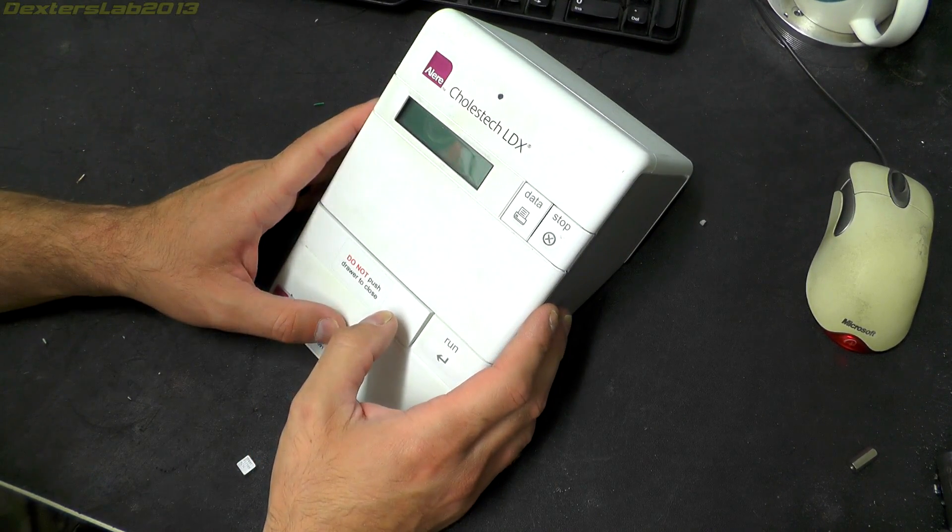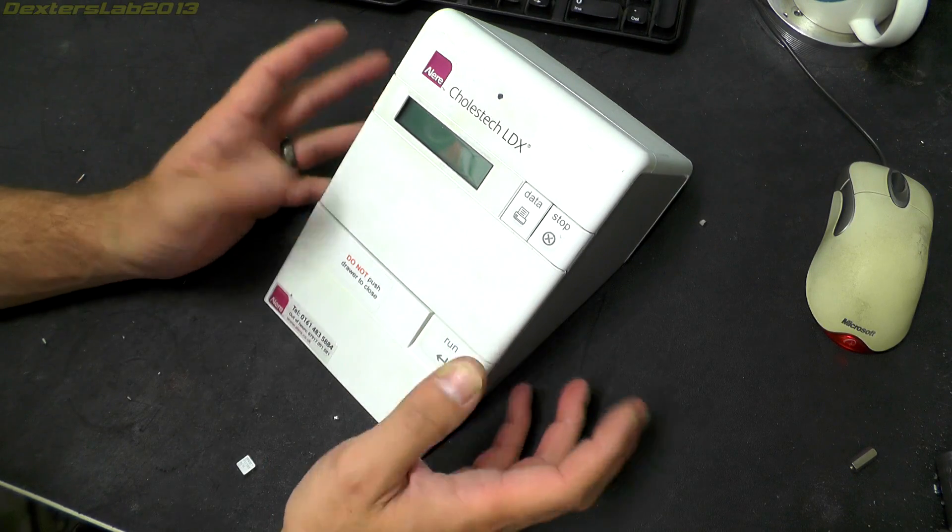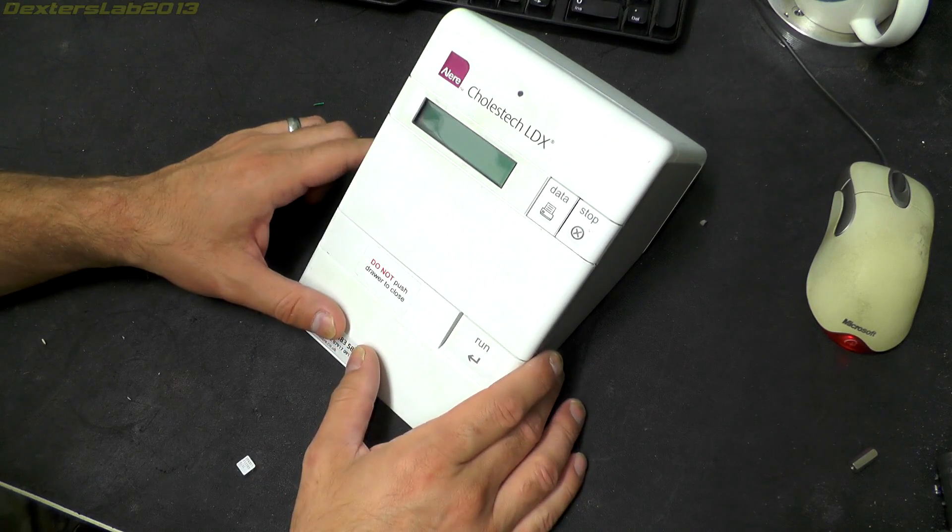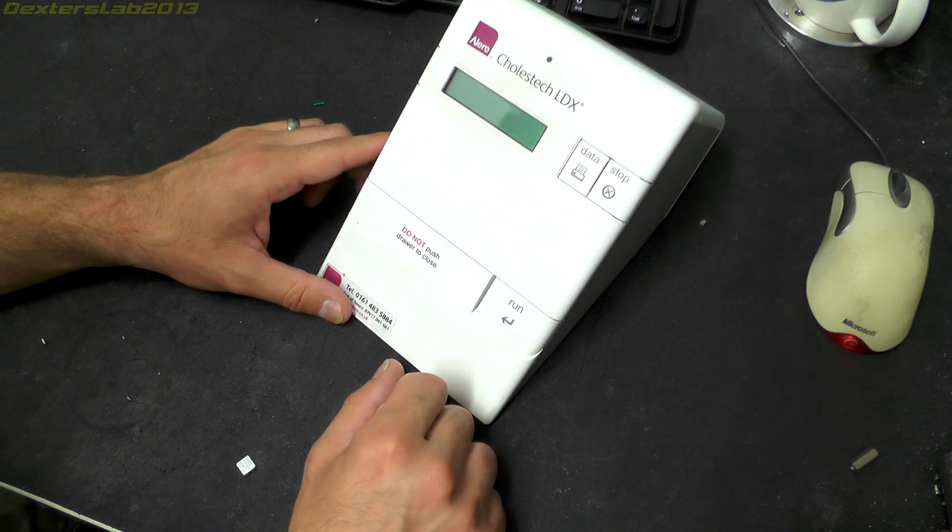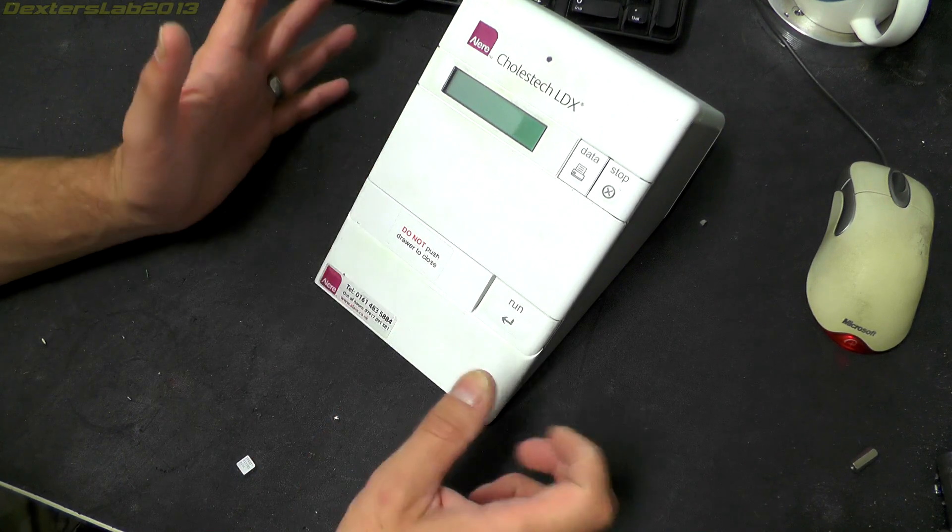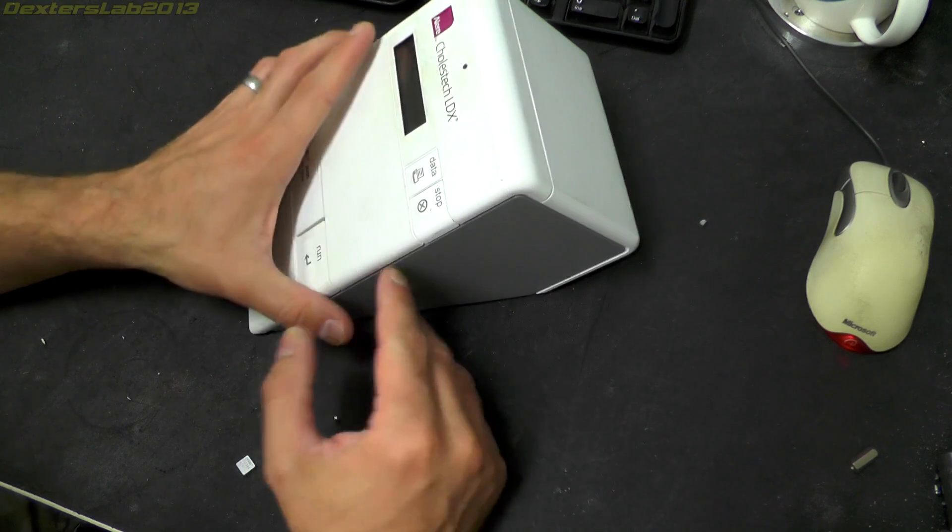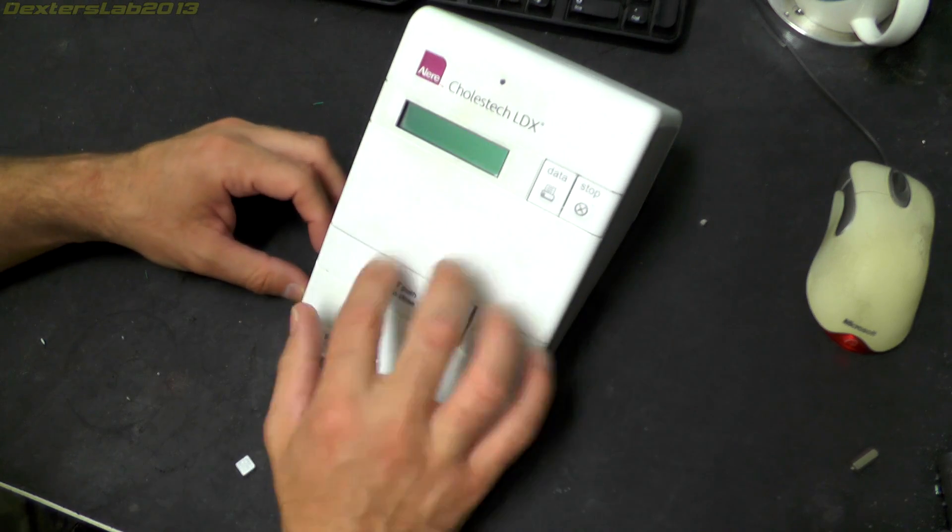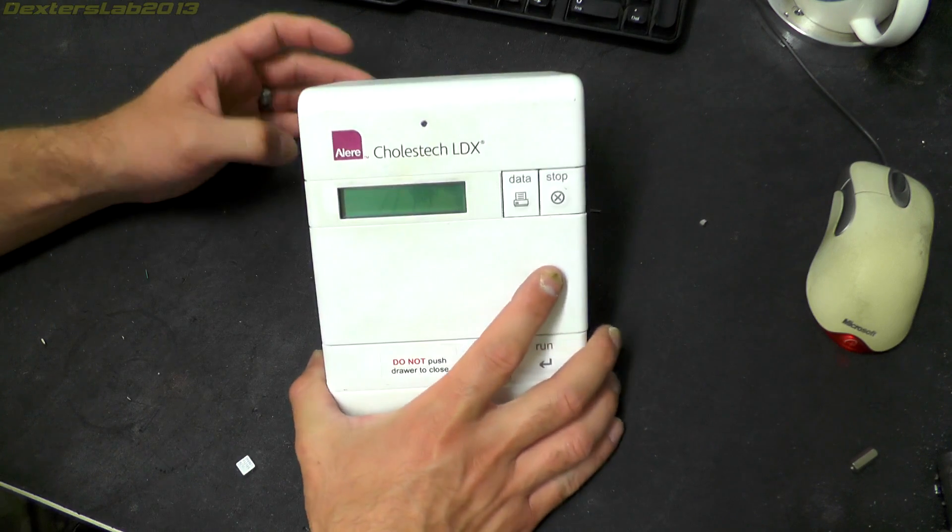What we have here is an Allaire Cholestek LDX, a cholesterol testing machine. You prick your finger with a little device and drop the blood into a small cartridge that goes in the front here. It does some kind of analysis and works out your cholesterol levels. Unfortunately, this doesn't work, otherwise I would show you it working or at least turning on. I don't have any of the cartridges, so I wouldn't actually be able to do a test anyway.